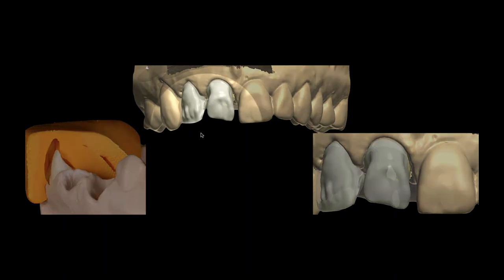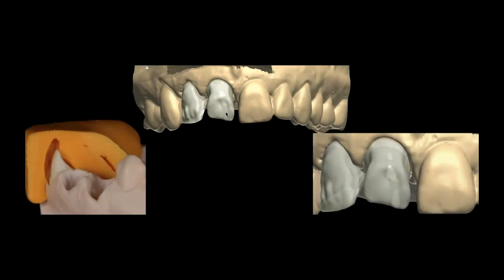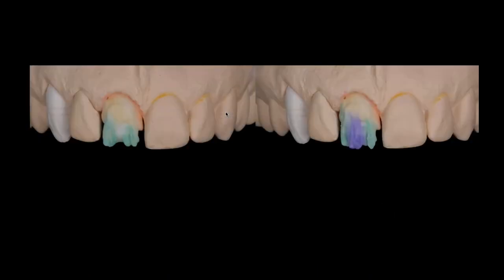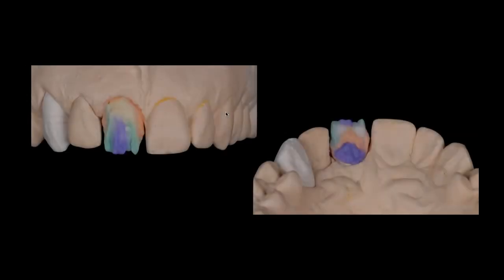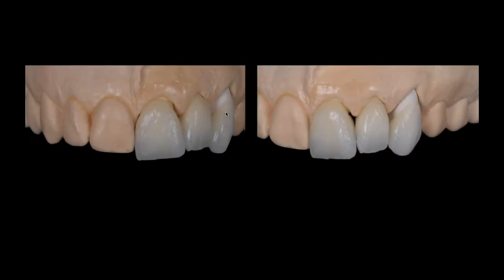So as I look close at these teeth, I want to understand, looking at the natural tooth, where does the light reflect? Where does the light absorb? And if I could use that information in my scanning process or in my designing process, then it makes life a lot easier for me from a ceramic point of view. The ceramics almost become easy at that point because I can use 3, 4, 5 powders, keep it much simpler, and again, be able to make them all look somewhat the same.